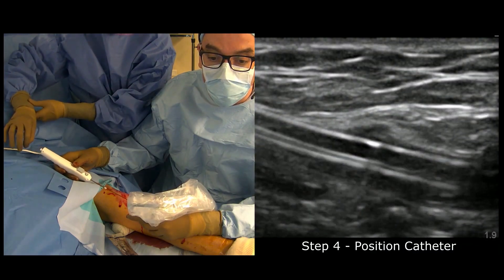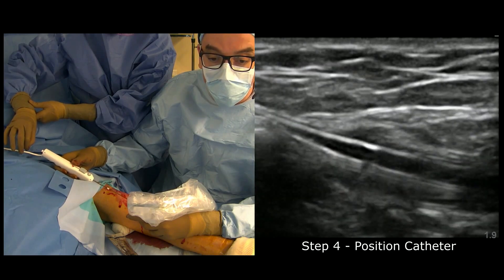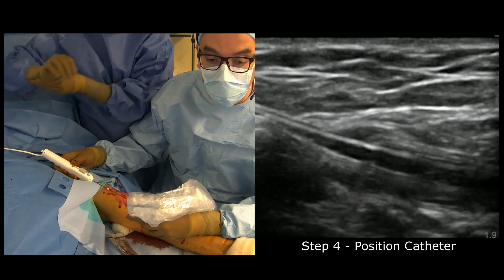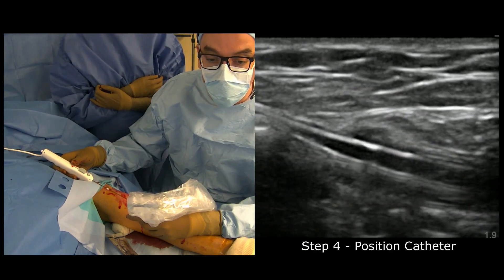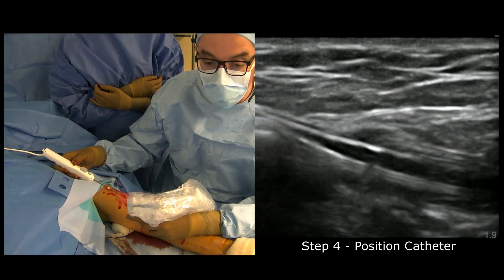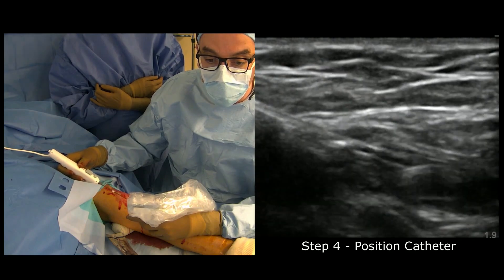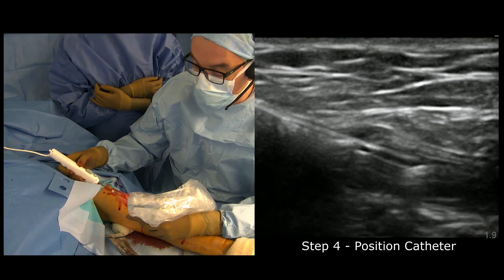We're going to put the device in. As you've noticed — and this is almost always the case — the vein is coming superior and lateral to the artery, in a position of about 1 to 2 o'clock. We will try to give this orientation to the device. Here the tip of the device is in, and then my resident will pull the sheath back.